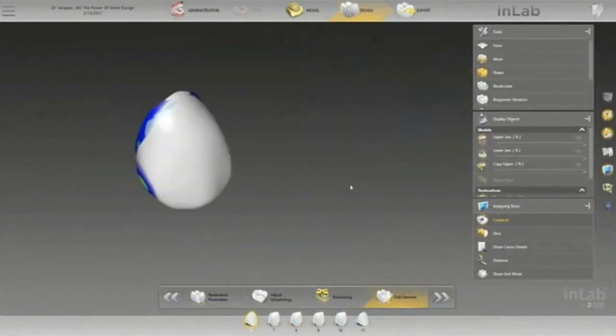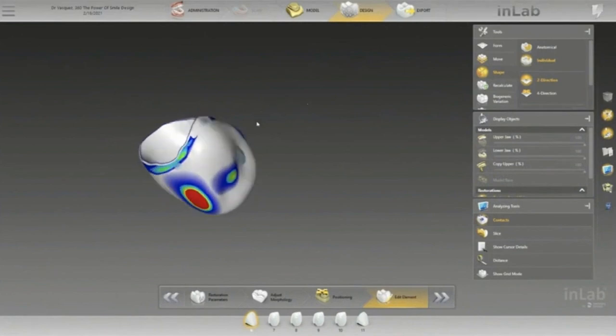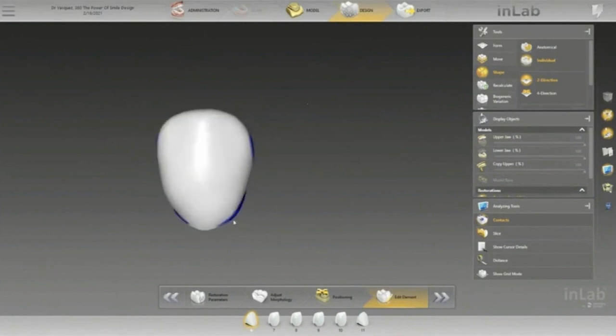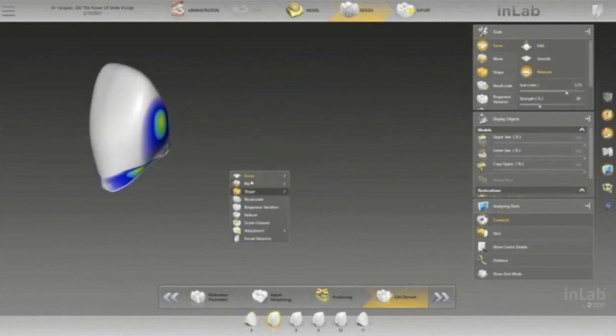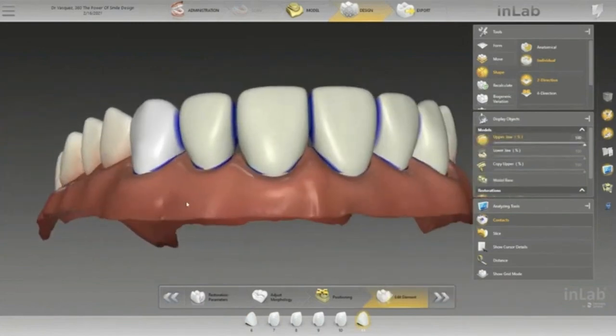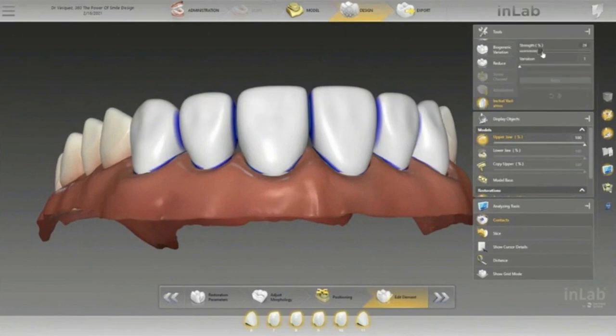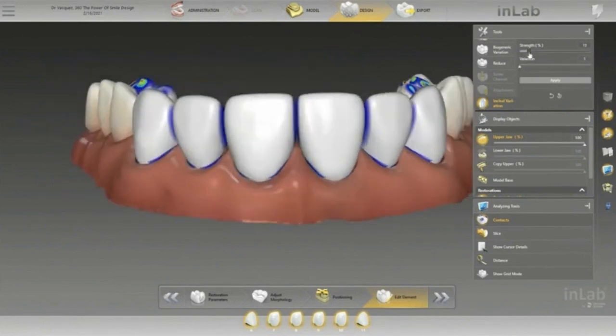The first thing I did is make my margin a little bit thicker. Right now I'm just doing the design, and this is going to be for the temporary crowns. Now, can you mill the permanent restorations out of this file? And the answer is yes. But I like to do temporaries many times, because we're going to work with soft tissue, and I want beautiful soft tissue before I insert the permanent restorations.